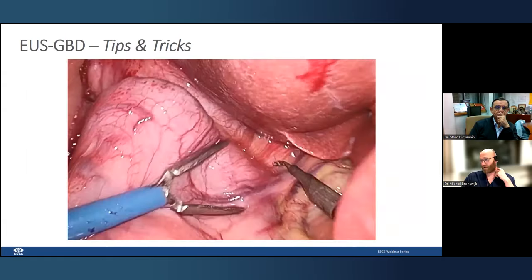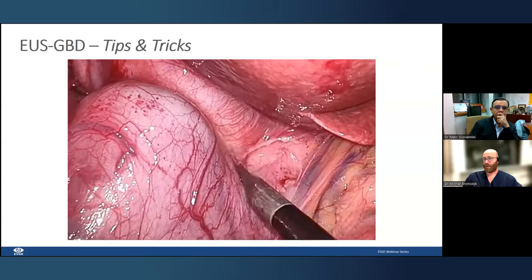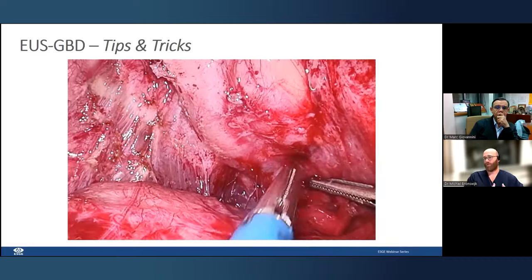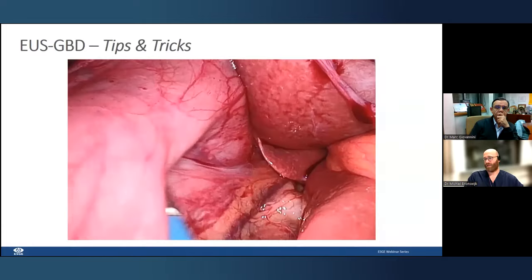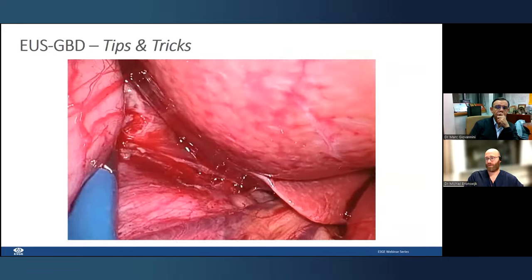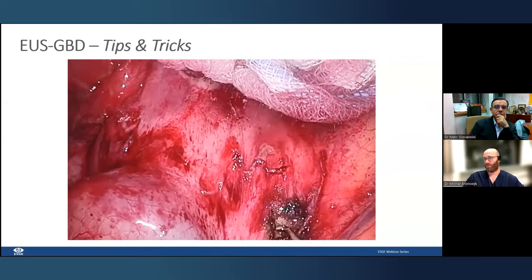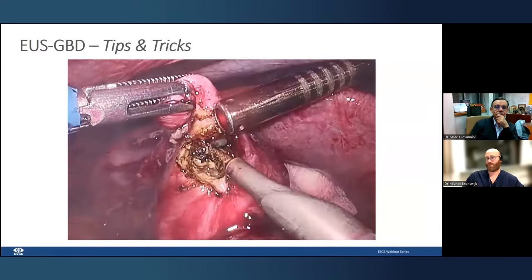What you also see emerging is a couple of studies suggesting a bridge to surgery, but do keep in mind that these data are limited. I know there have been studies that suggest that there's a safe gallbladder removal after the Hot AXIOS, but generally what the surgeons run into are lots of adhesions, and they reassure me that there's a higher risk of conversion to open cholecystectomy. That's of course something that we do not want in those patients. So perhaps something to be on the lookout for in the future, to have some extra data. But I would advise against performing this in potential surgical candidates.